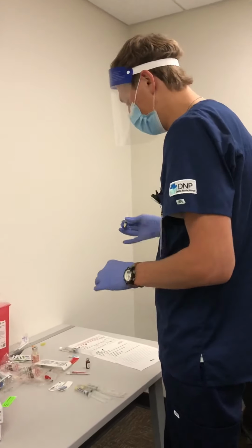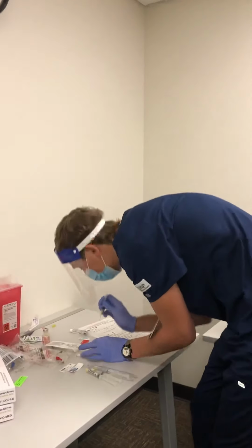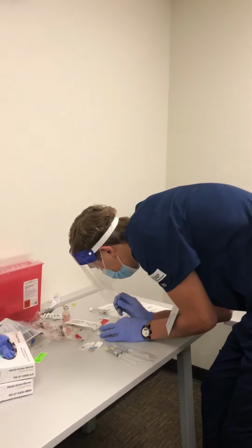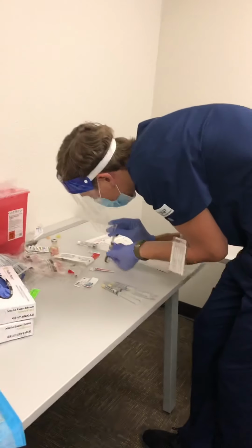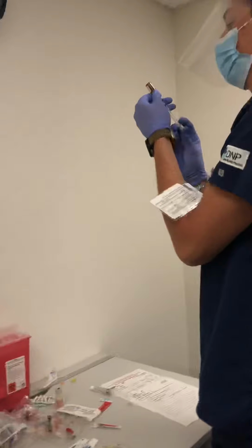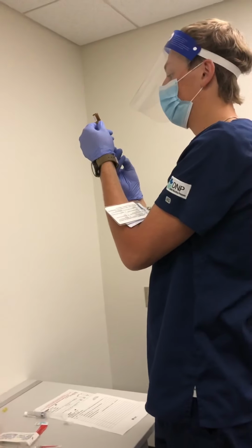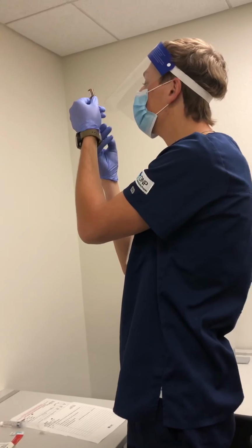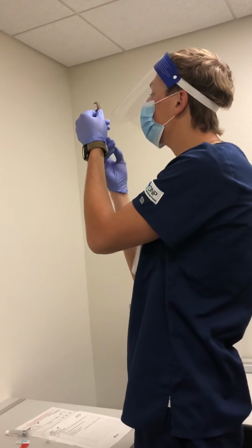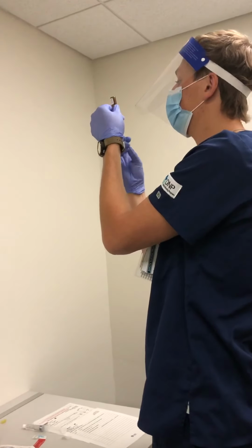And take the needle off. Instill that air into the vial. And then pull my medication, making sure to get all my air bubbles out.